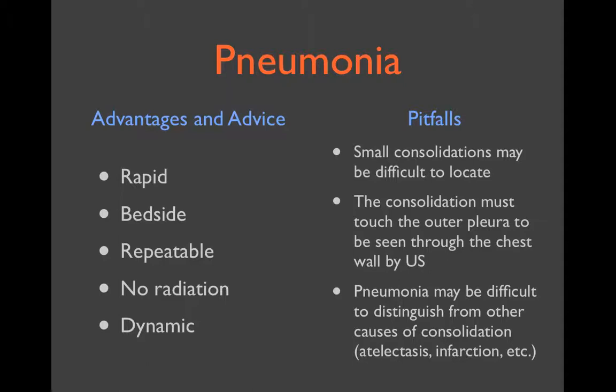As always, don't be afraid to just go look and start building your experience and therefore skill with ultrasound.